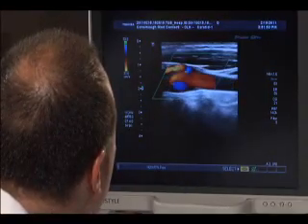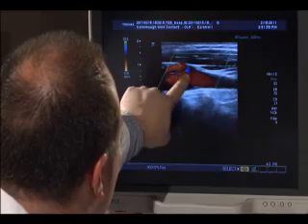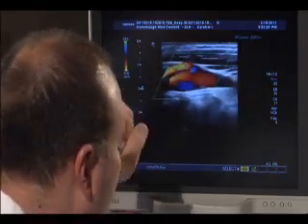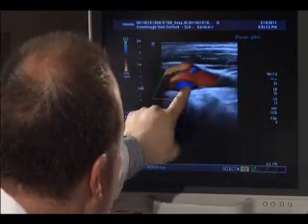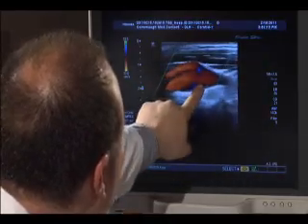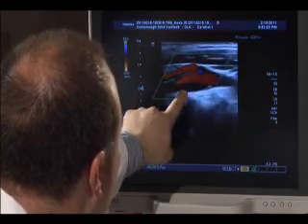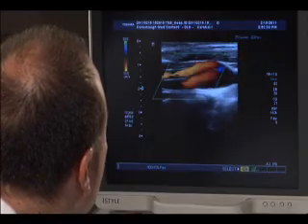And you said it's more likely to collect there? Yes. Because of the anatomy? If you see the different colors at the bifurcation or the split of those vessels, you can see how there's red here and blue, and what that's caused by is swirling blood at that level. Anytime blood flow travels through a tube that's not the same diameter the whole way through, or it splits into different vessels, there are what we call small eddy currents, which can spin around. The blood flow spins around at that level, and it causes a place in the vessel where the vessel wall may become slightly damaged, and that allows a place for plaque and cholesterol to seat and blockage to begin to form.